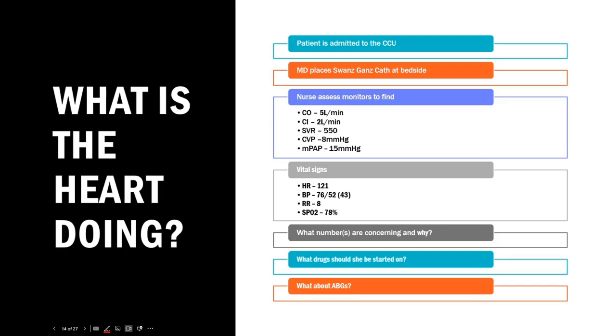So instead of going up by 5 micrograms, we're going up by 0.05 micrograms. So an easy mistake that can be made is putting in 0.5 micrograms per kilogram per minute instead of 0.05. So take your time and always verify your dosage with your rate.